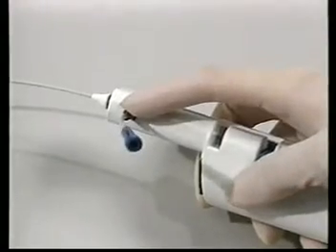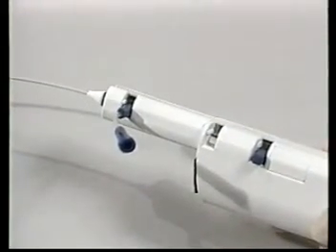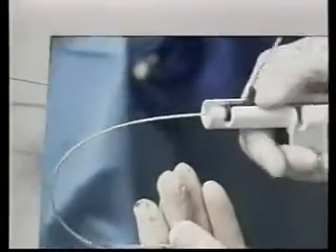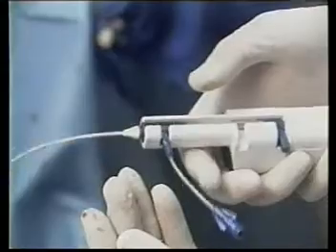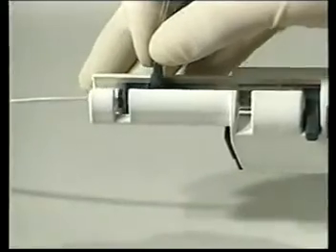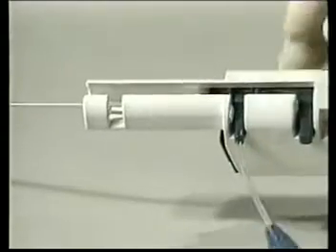Turn and lock the sidearm into the compression slot to prevent the outer sheath from moving. This is the compressed position, which is used to insert and position the catheter within the graft. To deploy the fragmentation basket, move it to the center deployment slot.